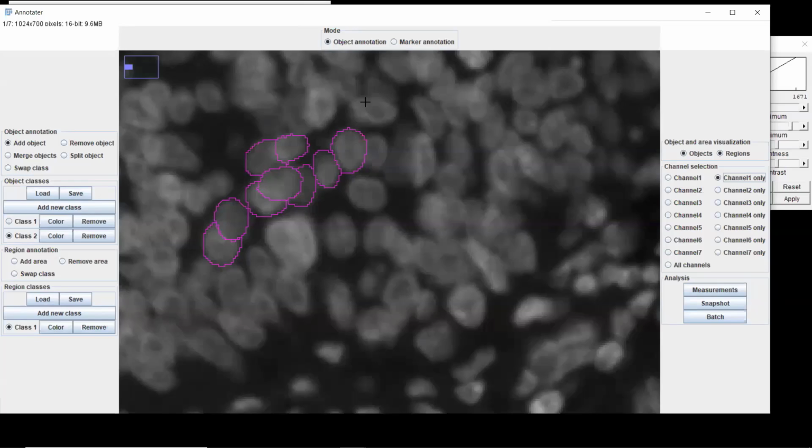And then you can feed a classifier to try not only to segment nuclei, but to segment specific nuclei. In our case, that's not needed. The way I do it, I don't think that is that useful because I'd rather segment nuclei and then segment the epithelium and segment the stroma, and then I have the same information. But that could be something you want to do, and for many applications that might be useful. So that's why you can have several classes.